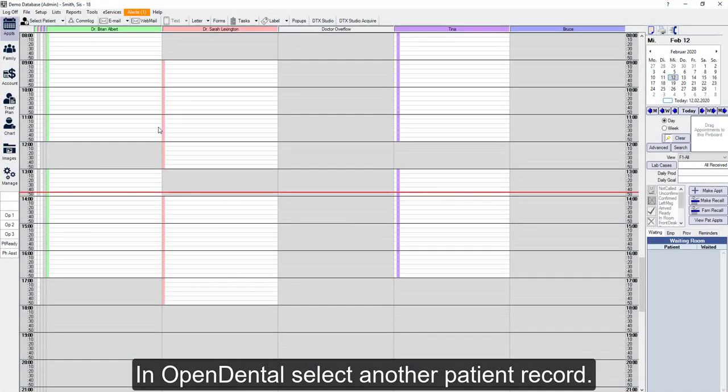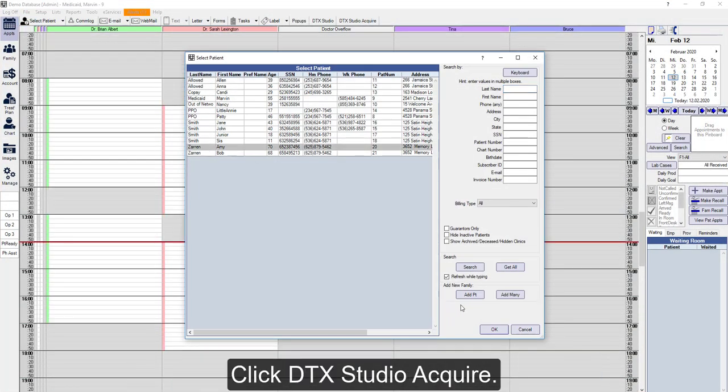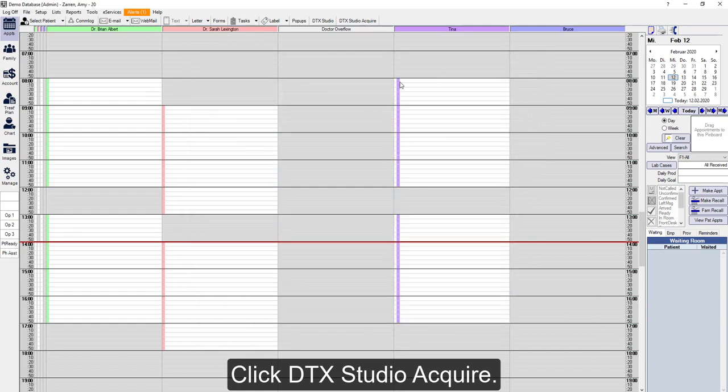In Open Dental we'll select another patient. Click DTX Studio Acquire to open the capture model in DTX Studio Clinic.